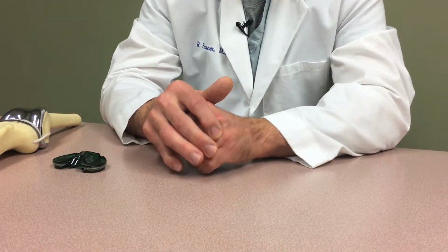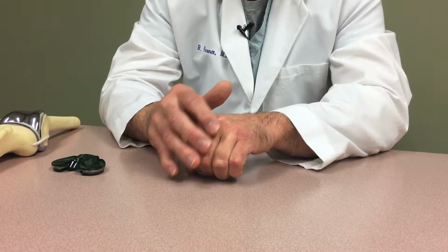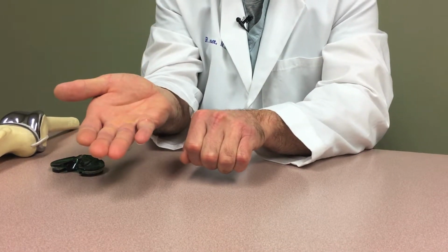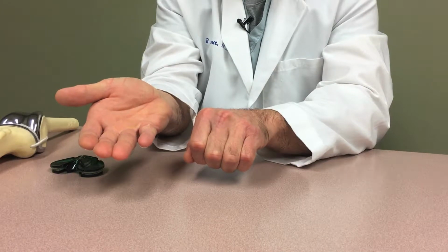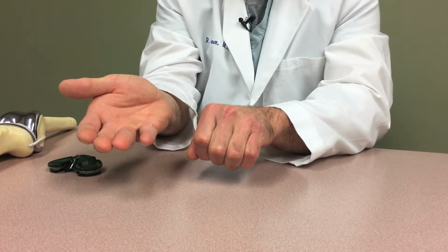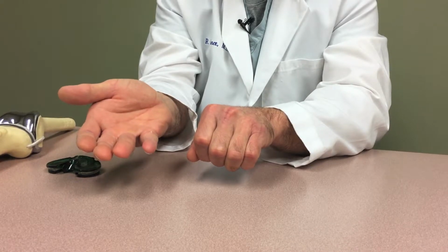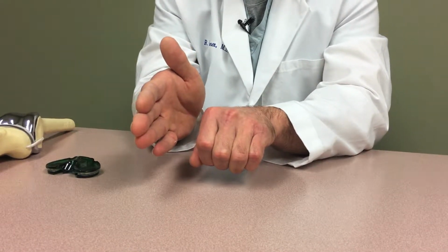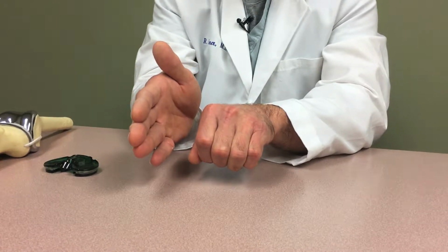No, you make a small incision in the front, and then you make your approach into the knee, and you slide the kneecap over. I never flip the kneecap over like that, because that can stretch the quadricep mechanism. So we just slide the kneecap to the side and keep it at what we call 90 degrees. The first procedure I do is prepare the kneecap.